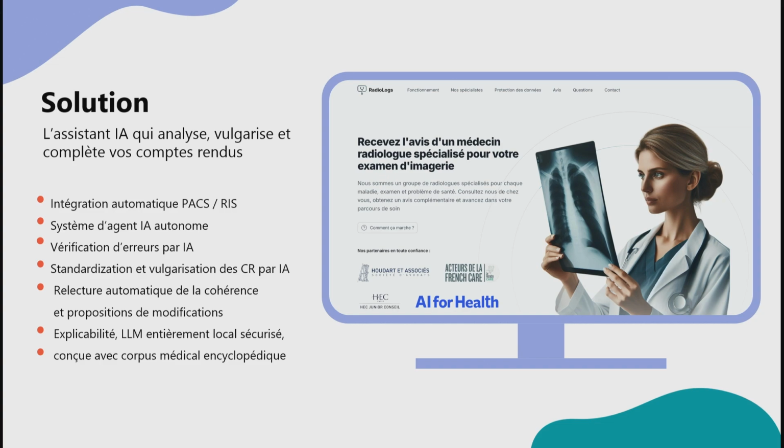So you can think of an agentic system as something quite simple. It's just an LLM, but you give it a bunch of tools and a bunch of access to other things that are not just chat. And you say, hey, if you need help, let's say from a database, or if you need some kind of image understanding, for example, in our case, with radiology exams, then it has access to these tools.